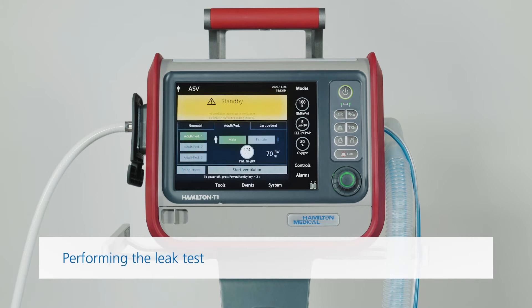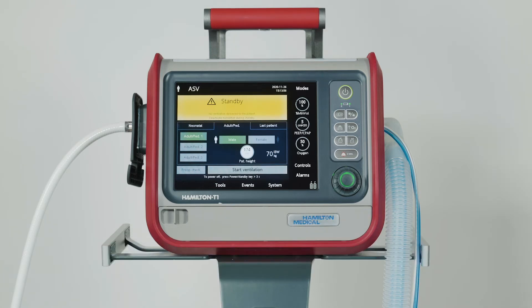Make sure you do a leak test and calibrate the flow sensor each time you've connected a new breathing circuit or component, including a flow sensor. The leak test checks whether there's any leakage in the patient breathing circuit. Wearing a glove is recommended for this test.